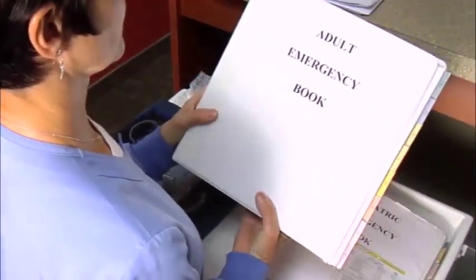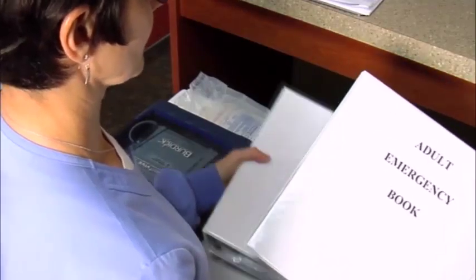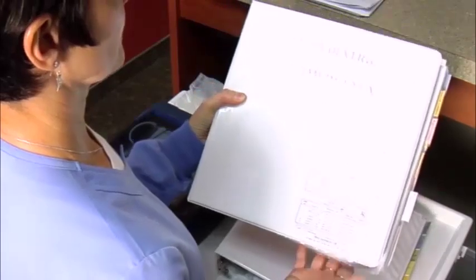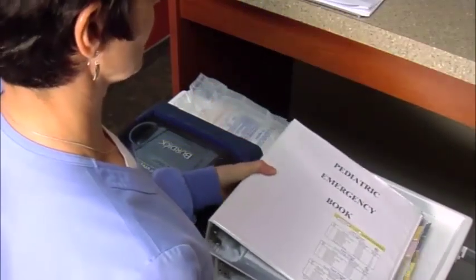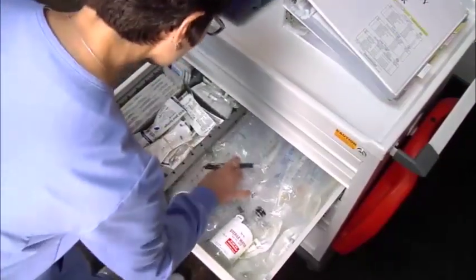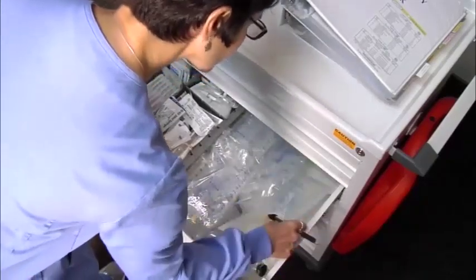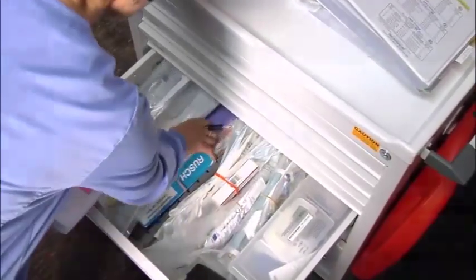An excellent way to manage this information is with a ring binder or folder that catalogs drugs and emergency equipment. If anesthesia is delivered to children, a separate ring binder is recommended, since drug dosages and treatment may be different for pediatric patients. Appropriately sized emergency equipment, such as pediatric paddles, ambu bags, airway adjuncts, and laryngoscope blades, must be immediately available in the OMS office where pediatric patients are treated.